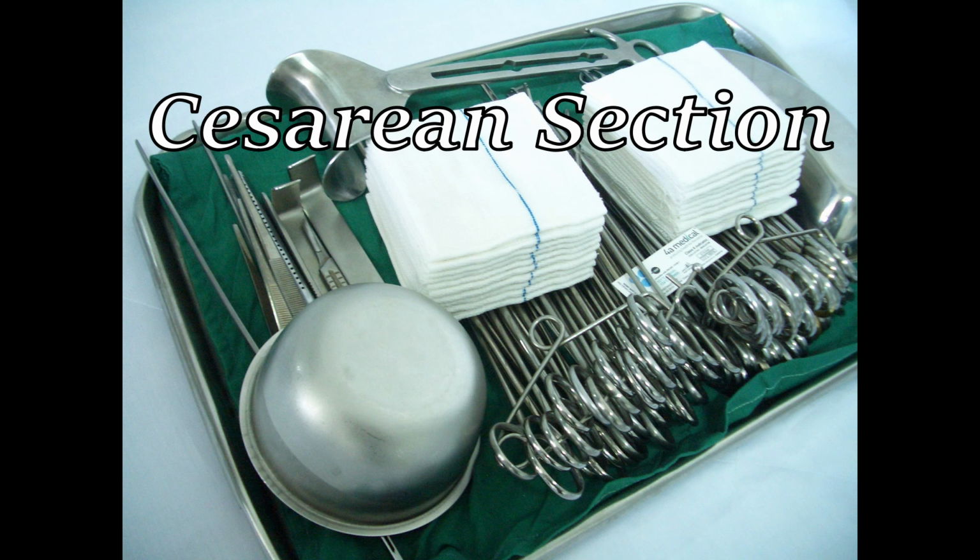The fascia is opened sharply and extended laterally with curved Mayo scissors and Richardson retractors. The superior margin of the fascia is grasped using Kocher clamps and bluntly separated from the rectus muscles. Rectus muscles are separated bluntly in the midline, and the peritoneum is opened to enter the abdominal cavity. Pearl. A sharp dissection of fascia, followed by blunt dissection of the rectus muscles, minimizes bleeding and preserves tissue planes.